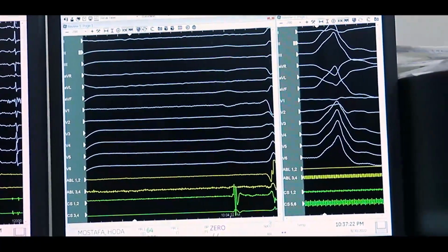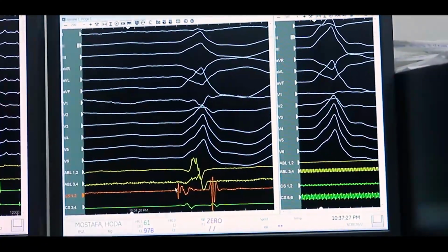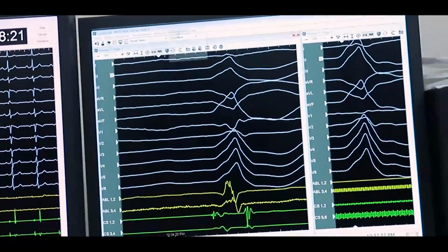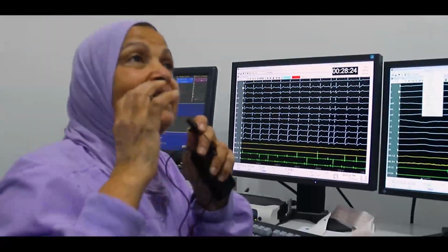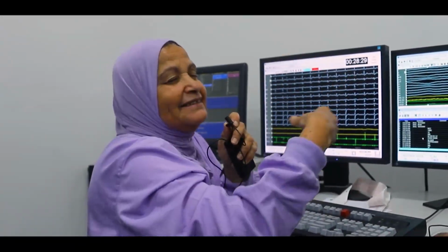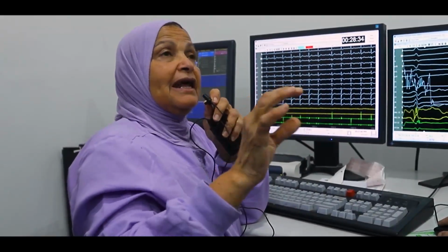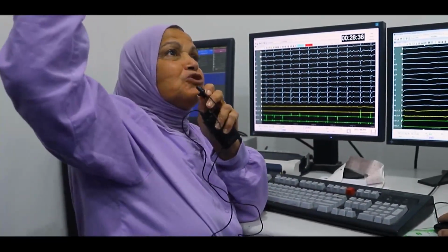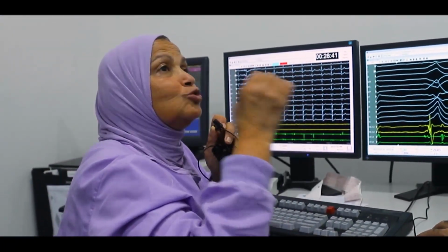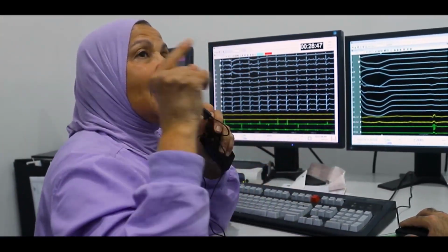I said okay, I'm going to go to the ventricle to target CS 1 and 2, and we will see this on the fluoro now. This is exactly what you think about with a left anterolateral accessory pathway, with a negative delta wave. I pushed the catheter into the ventricle because he kept the CS in this position. I liked it because this is the only site where the CS gave us 22, well 29. So this is my target.